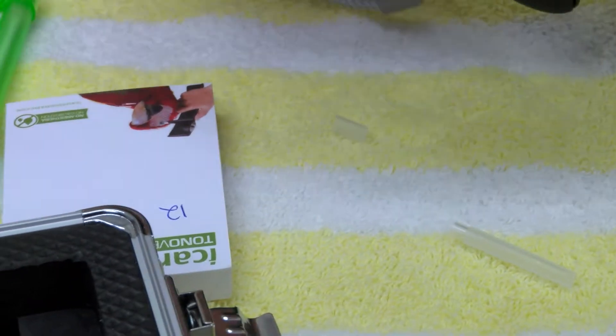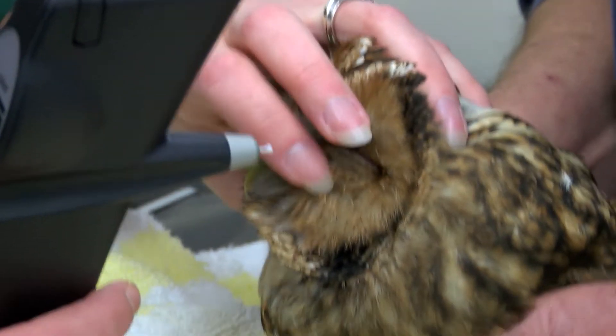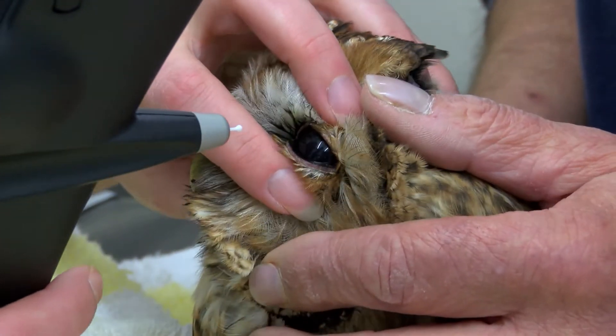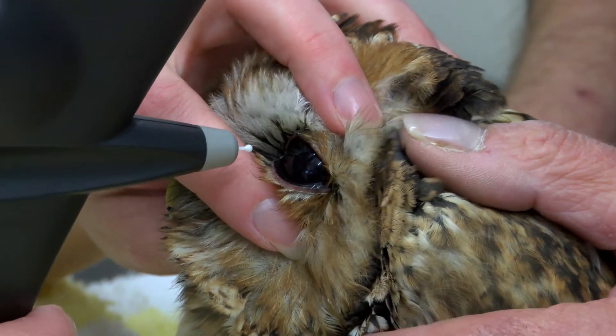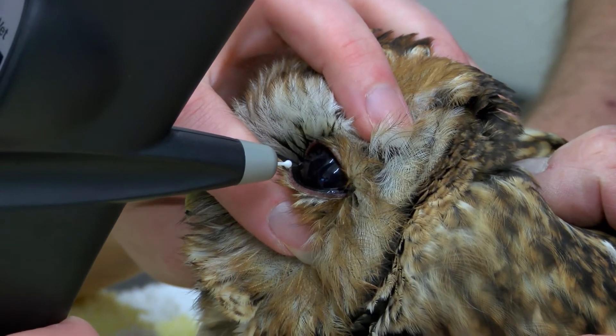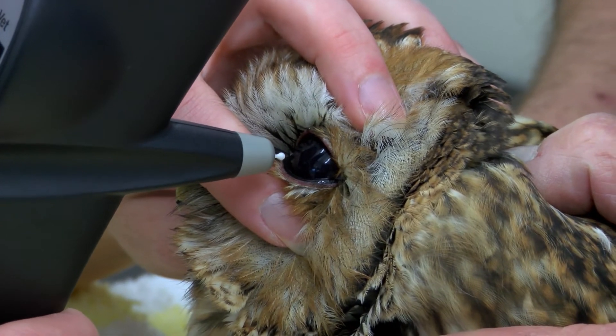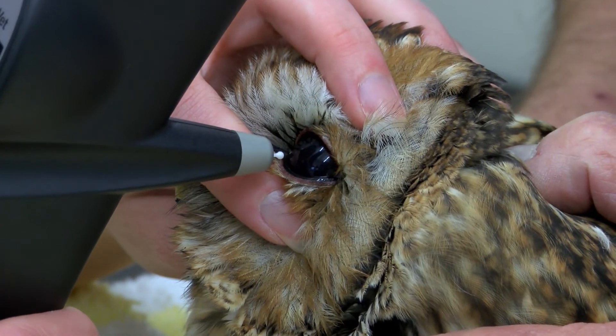So the good eye is normal, so now I just need to check the bad eye. It's important to have the head as straight as I can, and then just open the eye. There we go. It's amazing, isn't it — not worried about it at all.